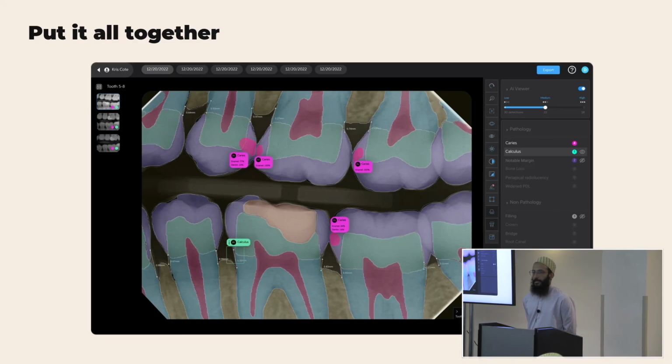The bone loss, you know how sometimes there's more in one area, is it able to detect the difference in darkness on the bone? That's what these little bars here are, I don't know if you can see them really well. It's pretty good about that. If it's a two-dimensional image and the buccal and lingual bone loss is different, it'll recognize the bone loss.